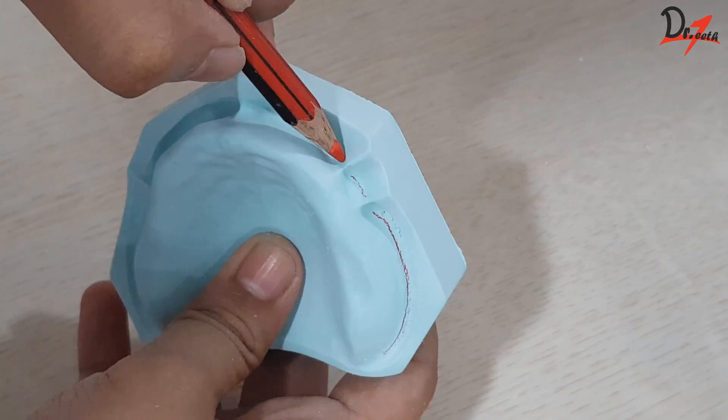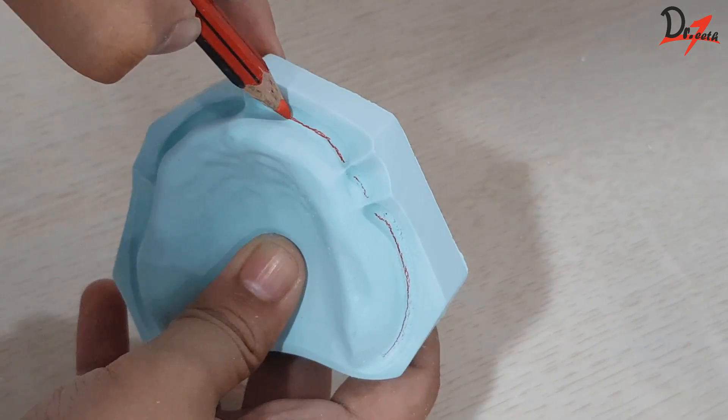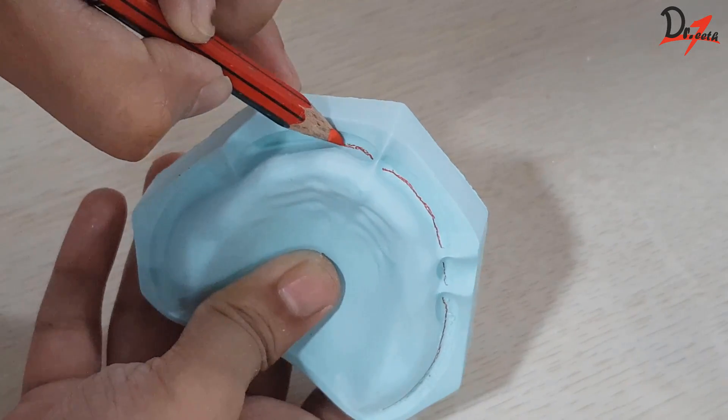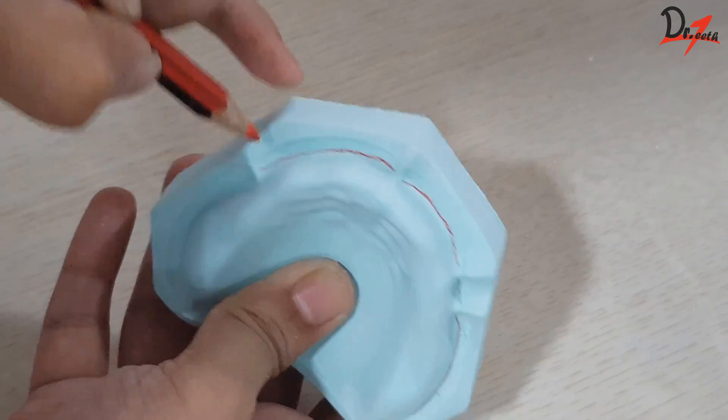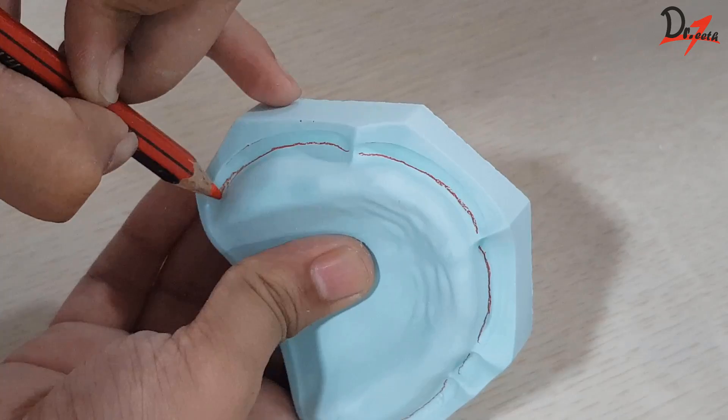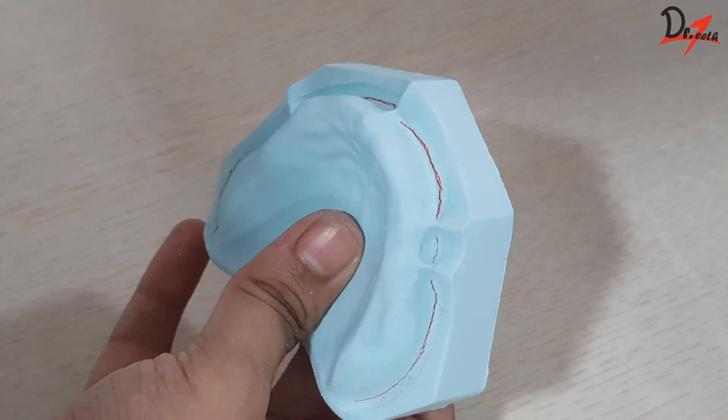So this will help us mark correctly the position of our custom tray, the position of our spacer. Because 2mm above this line should be the custom tray and 2mm further above should be the extension of the spacer.